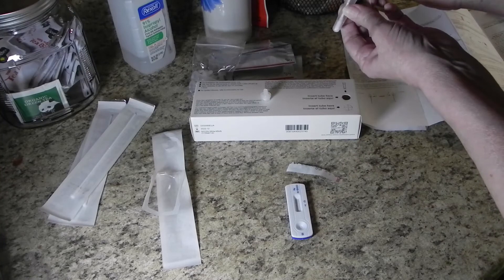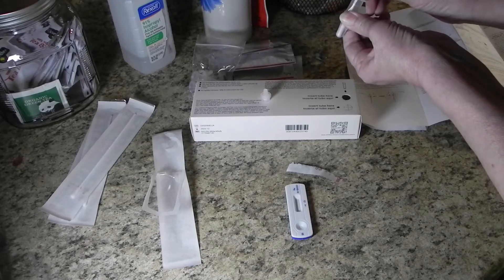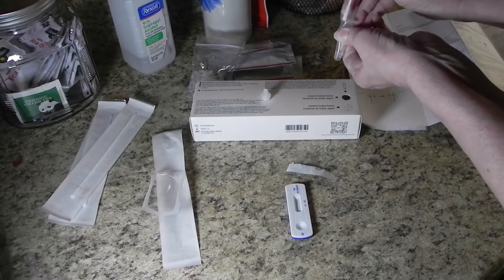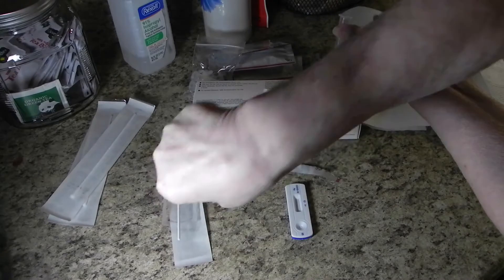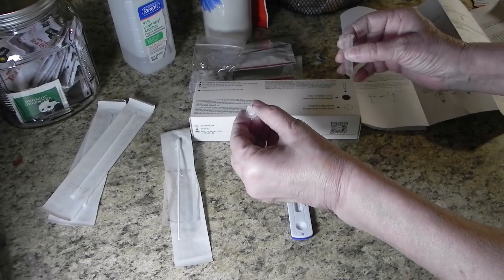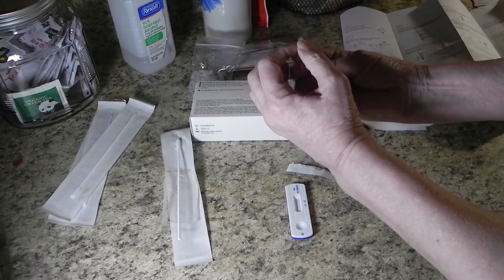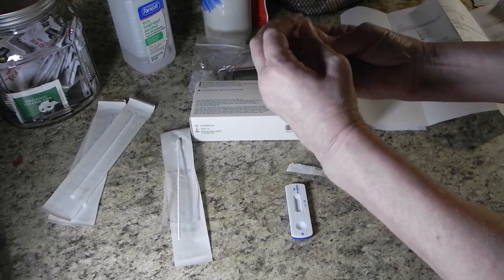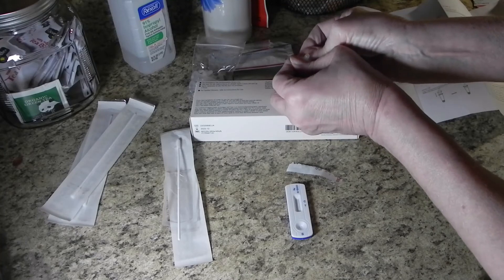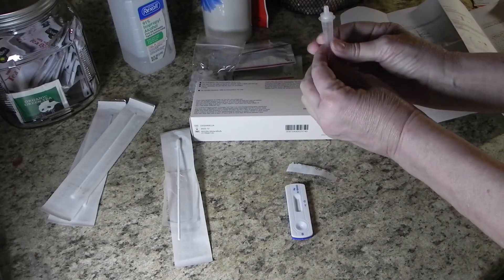Once your one-minute timer goes off, it's time to take the Q-tip out of the tube. Be careful — squeeze just above the tip of the Q-tip while pulling it out, and you can do this a second time farther up. Once the Q-tip is out, put the topper onto the tube. Try not to touch the very tip of it — carefully put this plunger top on and close it really tightly. This turns the tube into a dropper so you can add drops into your test cartridge.